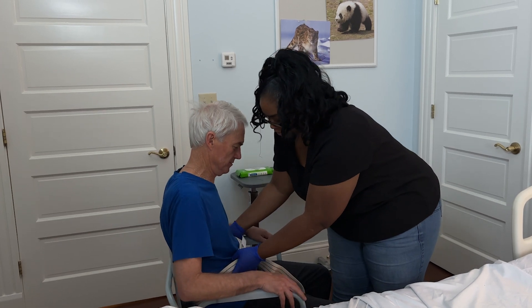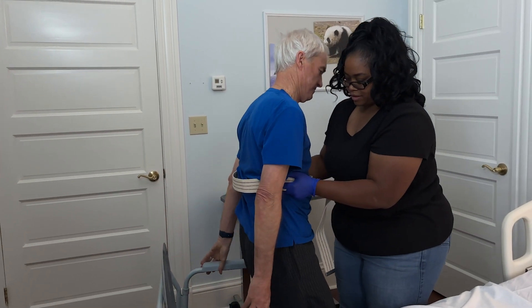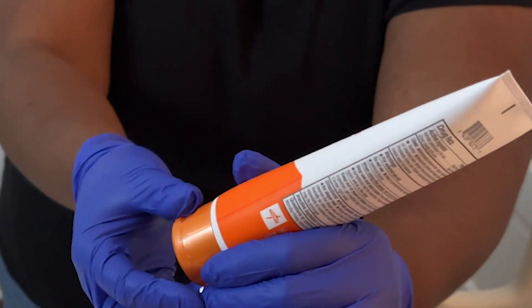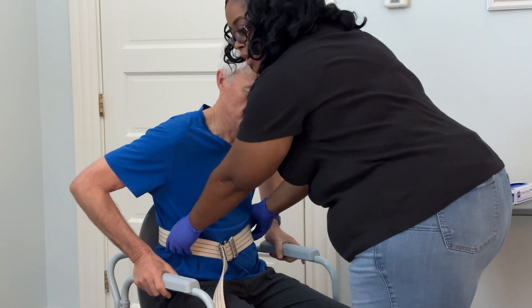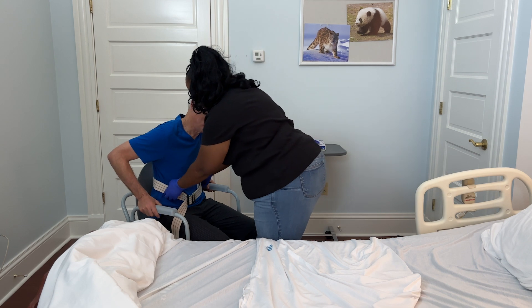Start by using the gait belt. Then ask your loved one to place their hands on the bedside commode to help push themselves up. Once they are standing up, you can assist them with getting clean. Apply any creams if ordered at this time. Assist your loved one with pulling up their undergarments and pants. Now that your loved one is ready, review the pivot process with them, reminding them not to place their hands around your neck, but on your hips.